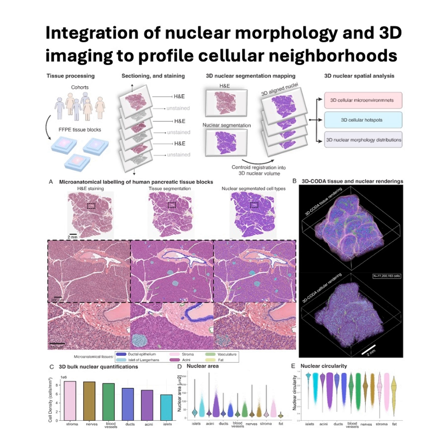Okay, that makes sense. So you have the 3D structure rebuilt digitally. What's next? Identifying what's what? Yes. That's where semantic segmentation comes in. First at the tissue level. Semantic segmentation, meaning teaching the computer to recognize different tissue types. Pretty much. They use the CODA semantic segmentation algorithm to label the major pancreatic tissue types.